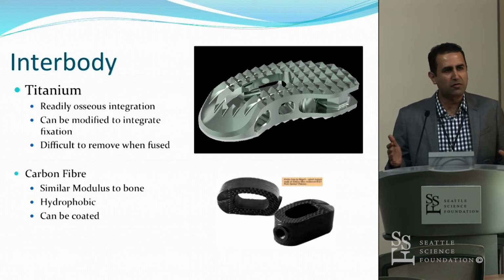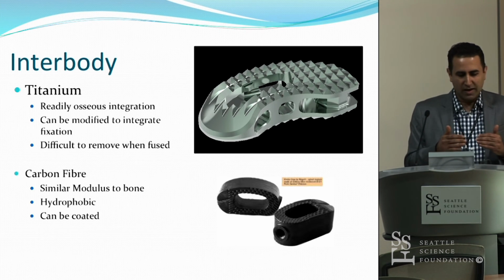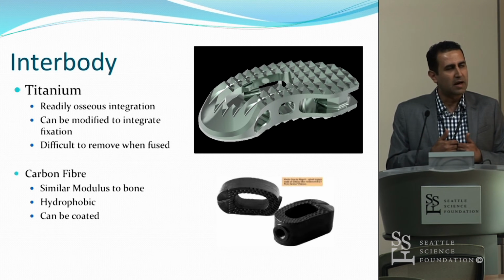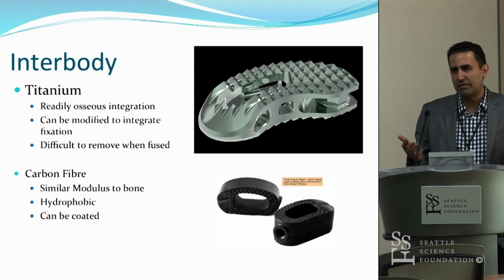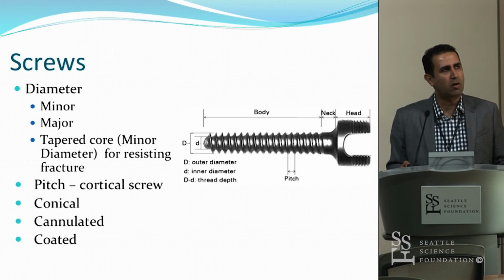The problem is it's hydrophobic, so in theory it'll push the interface away by not absorbing water or fluid in that region. But the way around it is by coating it again. So it's becoming much more of an option.